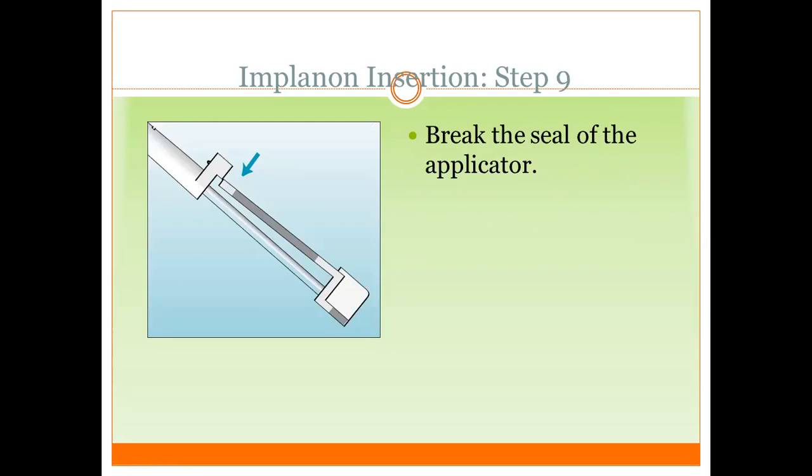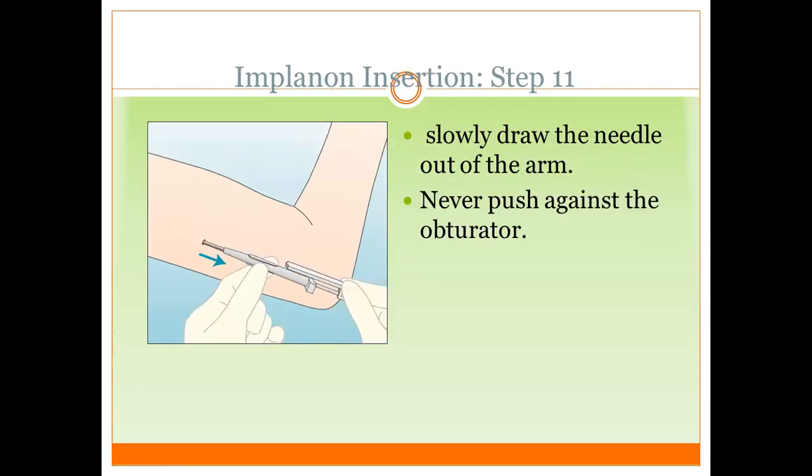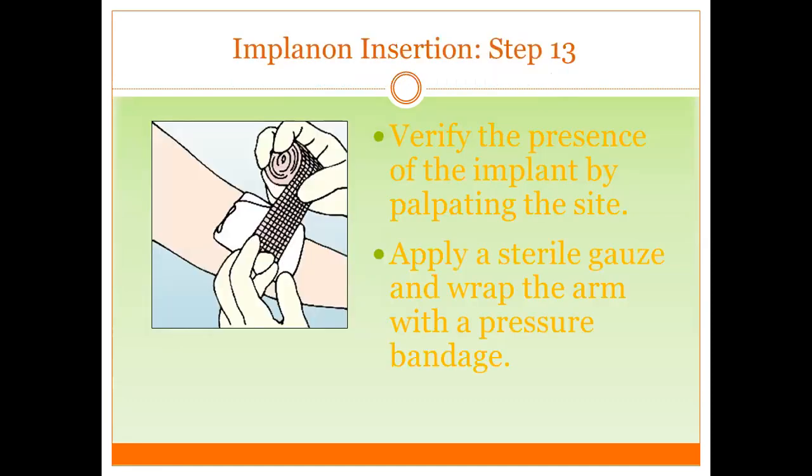Once positioned, break the seal to deploy the Implanon. In the old version, rotate about 90 degrees; in the new version, there is no need to rotate. Then slowly withdraw the needle from the arm — never push against the obturator. Lastly, check the needle to make sure the implant is absent from it and is inside the body of the patient. Verify the presence of the implant by palpation — it should feel like a small rod. Educate the patient on how to palpate it.